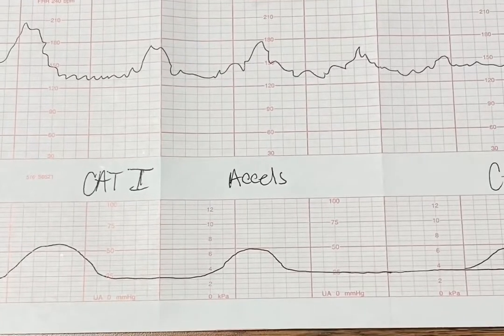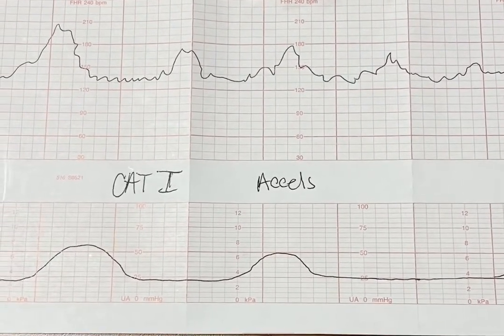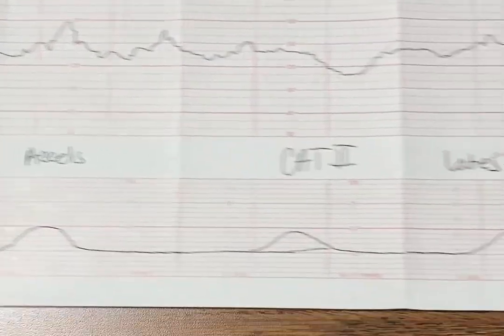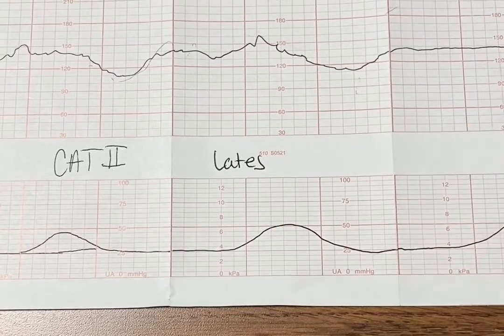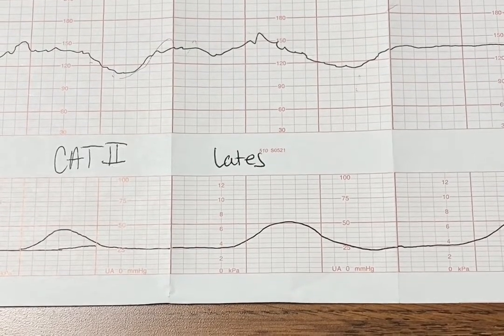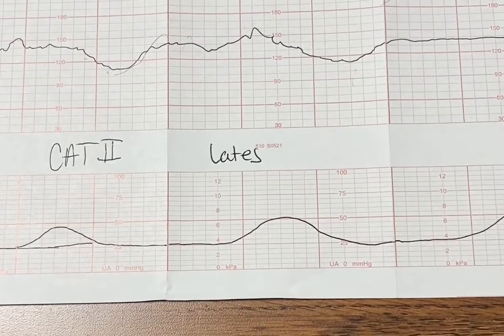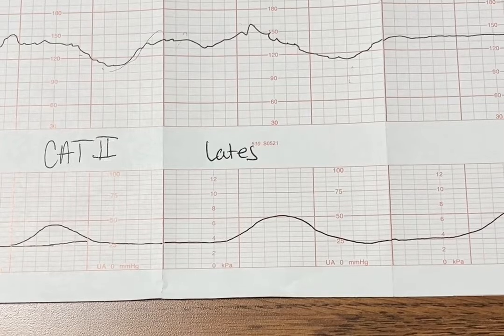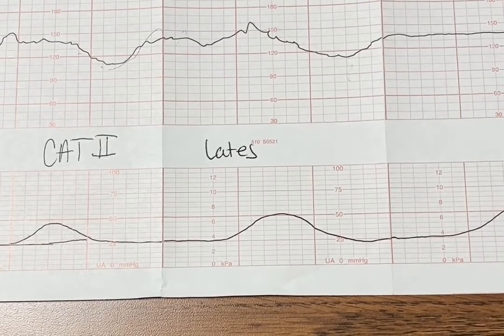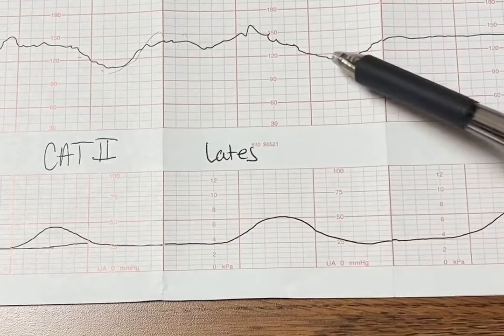In this category 1, you see accels. With the accels, that means that there's adequate oxygen to the fetus. So we did already say what category 2 is, but this is late decelerations. Late decelerations are placental perfusion problems. This means that the fetus has had late recovery from the contraction squeeze. And you'll see that it is late from the contractions.